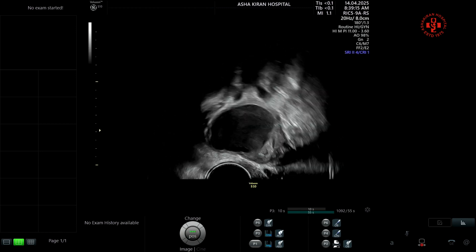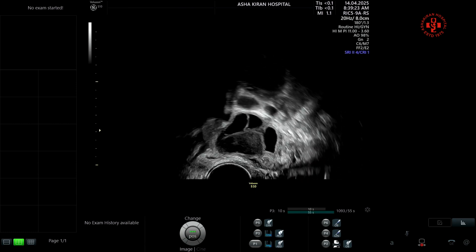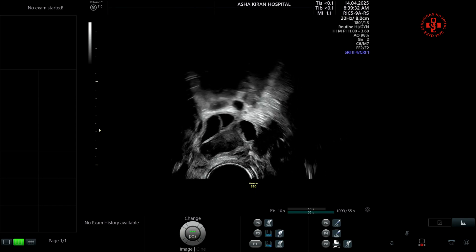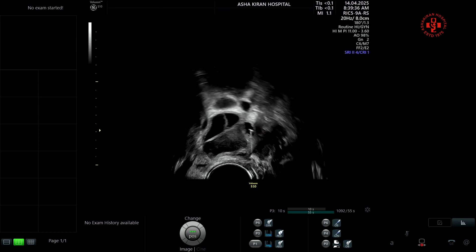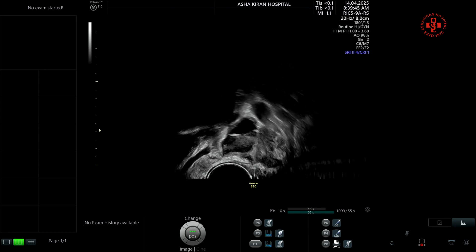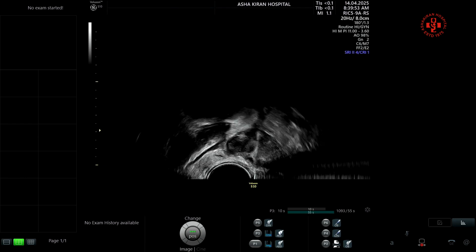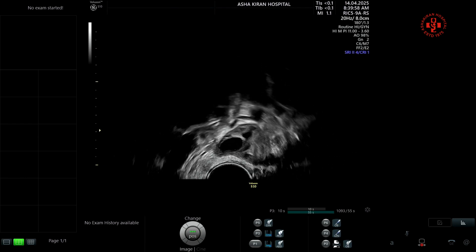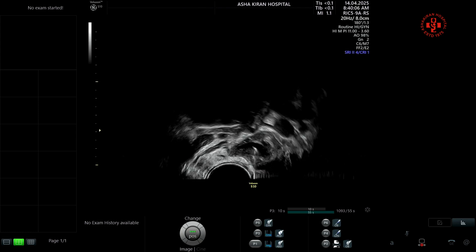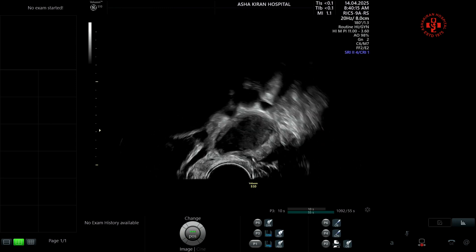Now I'm going to show you the brush technique itself. This technique is designed by our own team and is very helpful in preventing contamination of the follicular fluid. It does not disturb the endometrioma and has not caused ovarian abscess in our series of thousands of patients — this is well documented. The suction pump is only activated when the needle is inside the follicular fluid; I do not activate suction when at the periphery of the endometrioma.